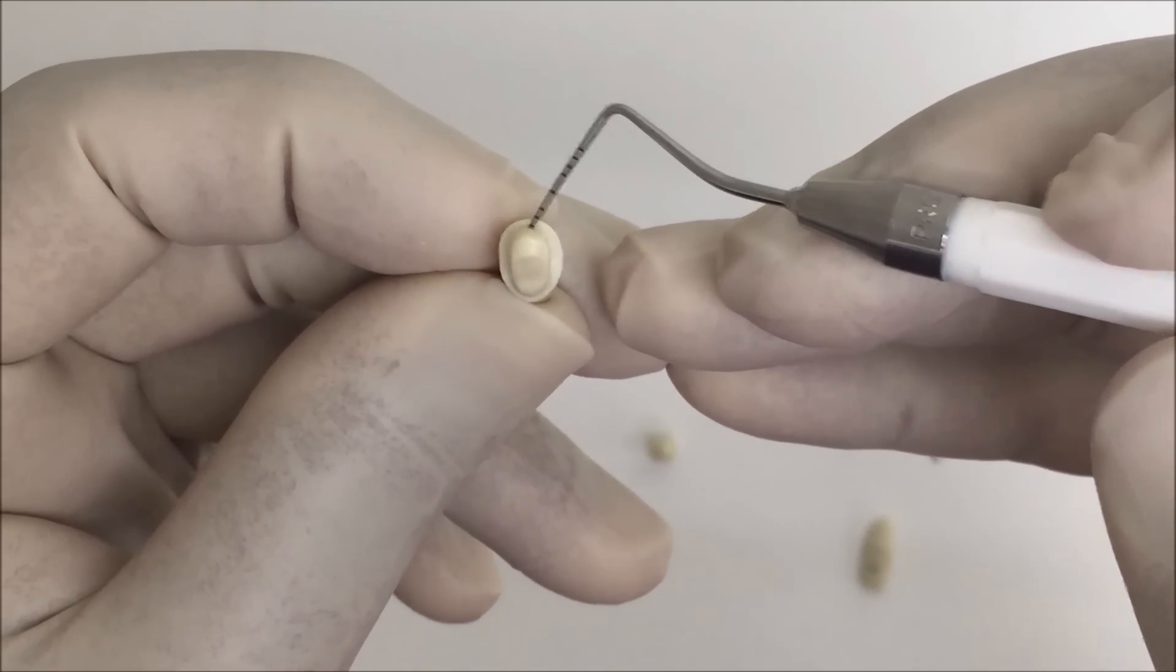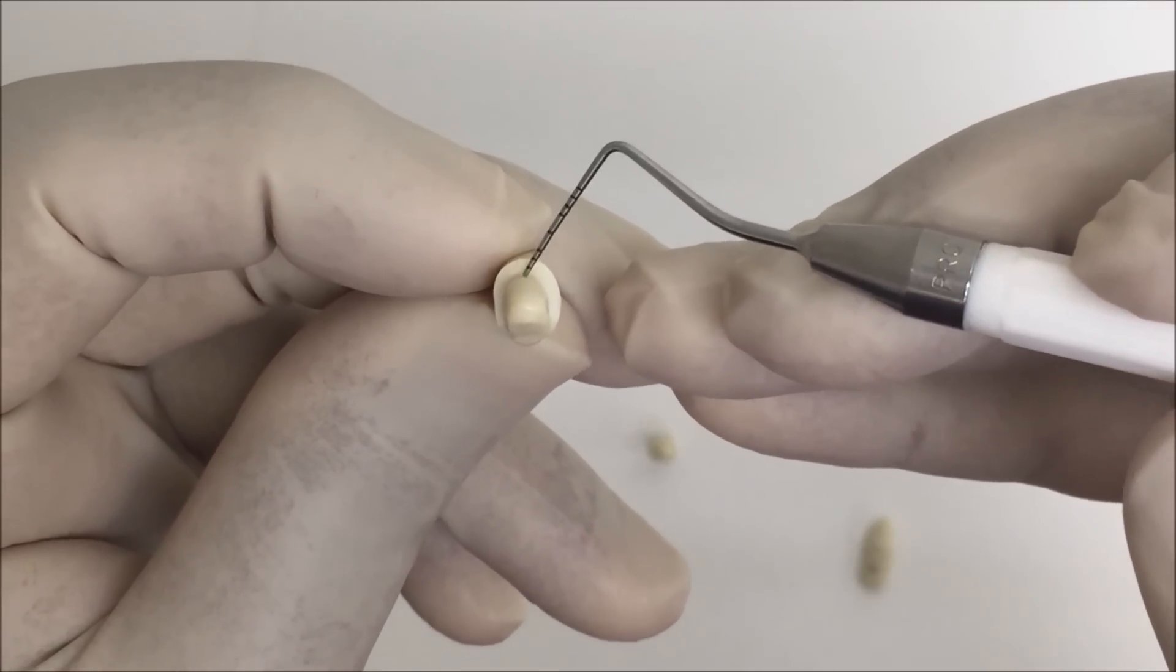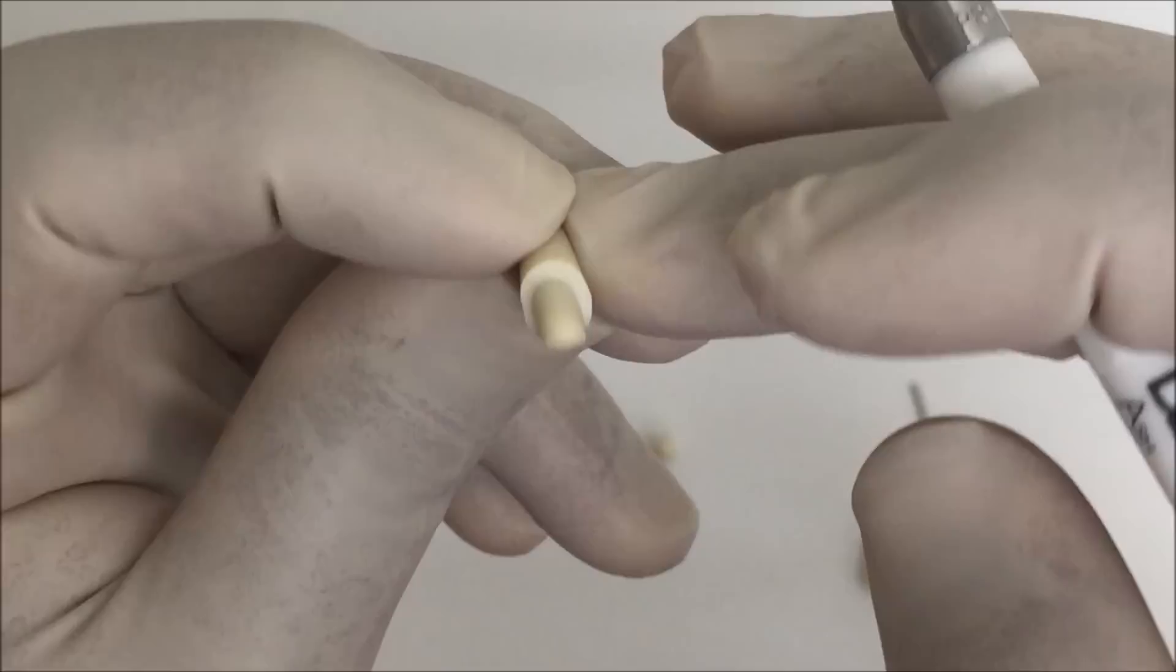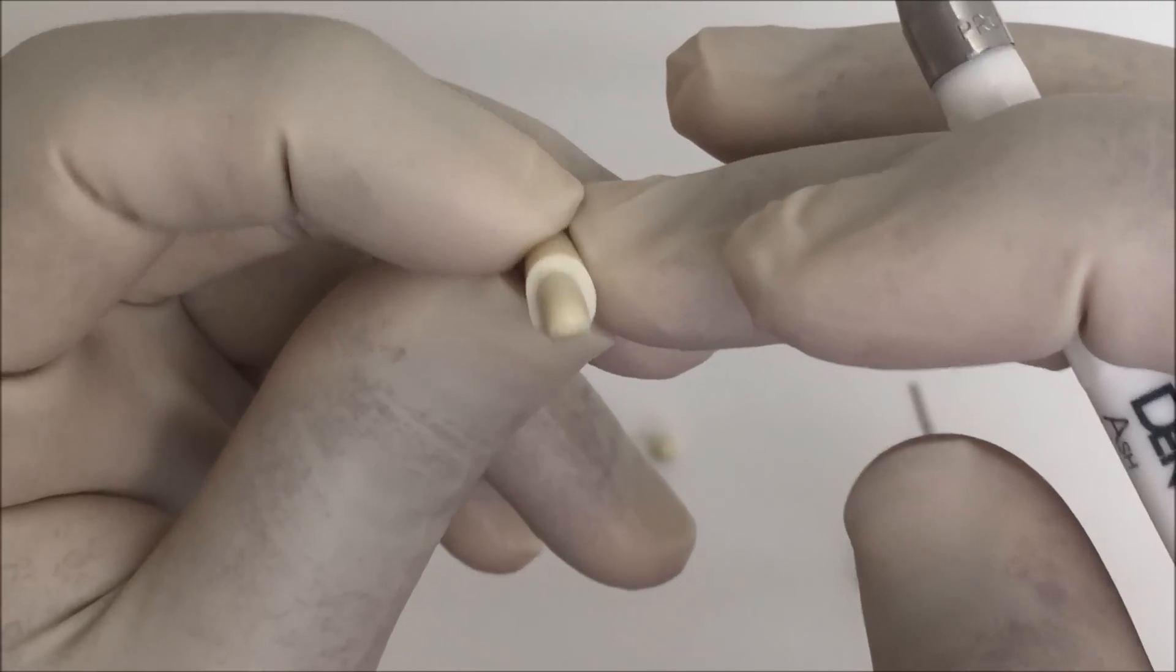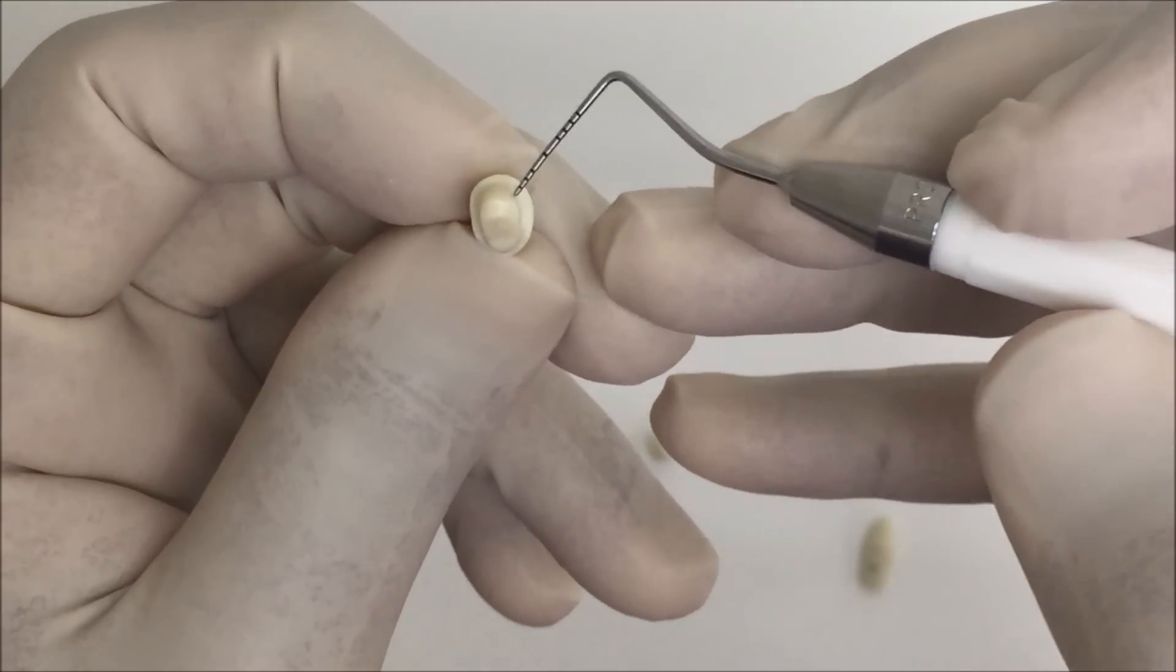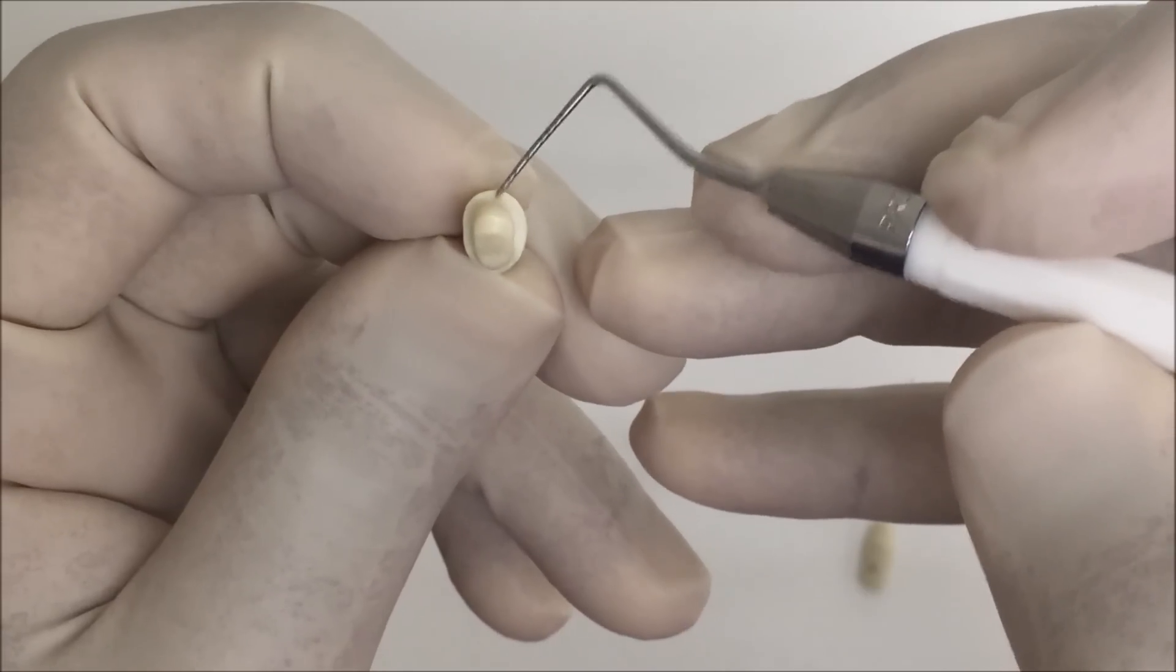So it will only be visible if you tilt the tooth to show it, but from top view it will not show the full circumference or the full width of your margin.